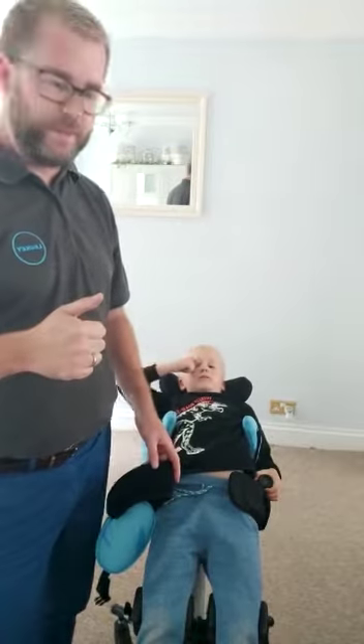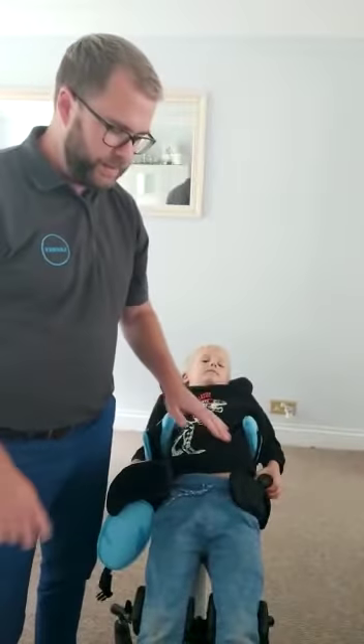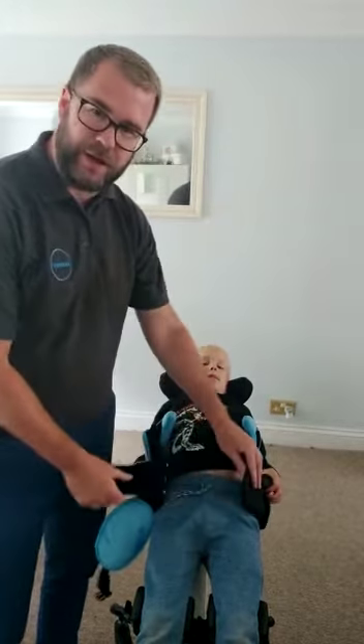Hi guys, so now we've taken our measurements, we've set up the standing frame to those measurements and now Maxi is in there. The first thing we always do, no matter if it's a chair, walker, or stander, is our lap strap first — our pelvic strap.